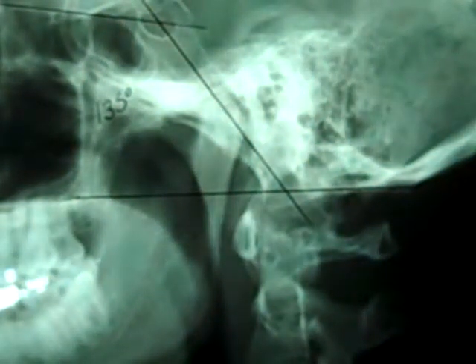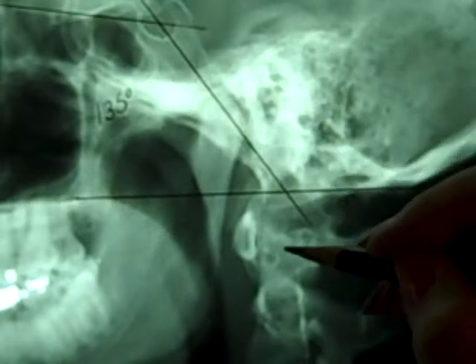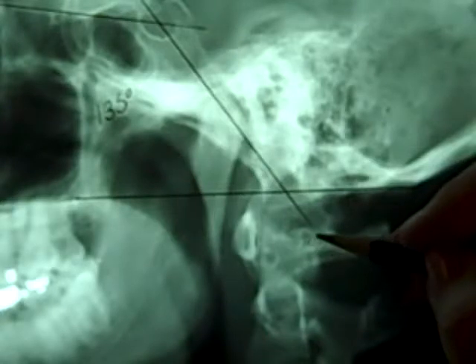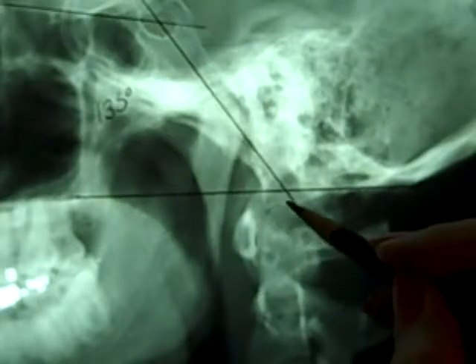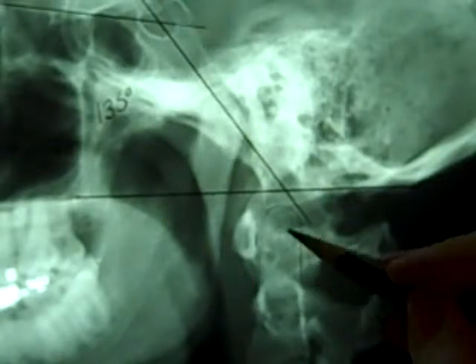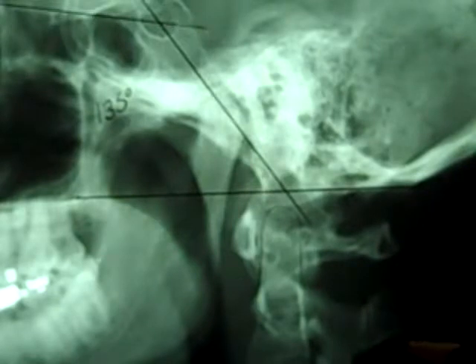Now what I'm looking for is the odontoid process to not be more than 8 millimeters above this line for males and not greater than 10 millimeters above this line for females. When you look at the odontoid process, which on this film is right across here, and here's the back of it right there. If I drew that in for you, that is the odontoid process.